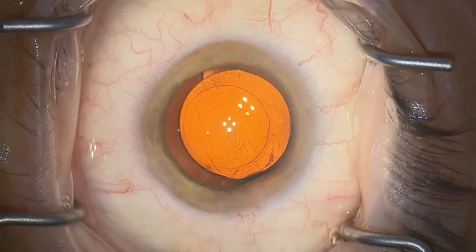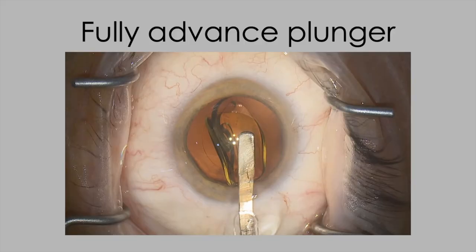Ready to remove the viscoelastic. There are many lens injection systems and lens types, but this is a common and widely available system and the points here should be generally applicable. I particularly like using the plunger over the top of the optic as an instant manipulator after lens injection — something you can't do with some of the more modern pre-loaded lens injection systems.